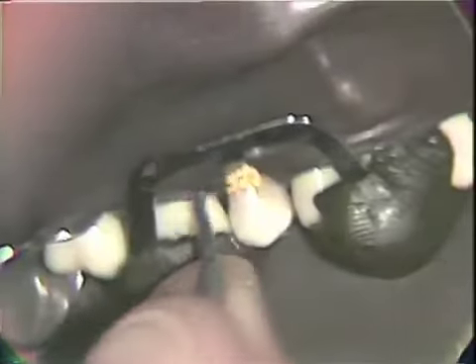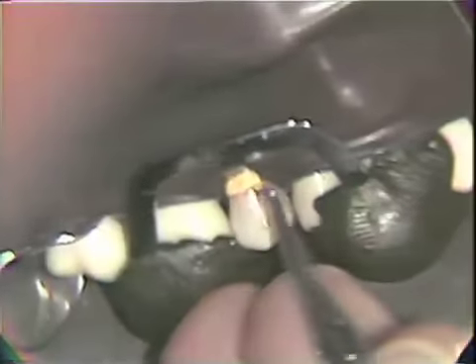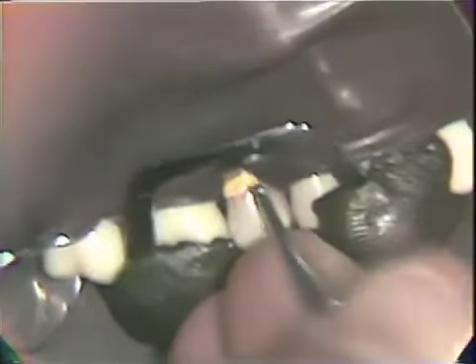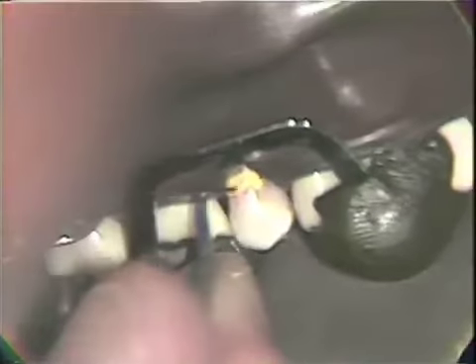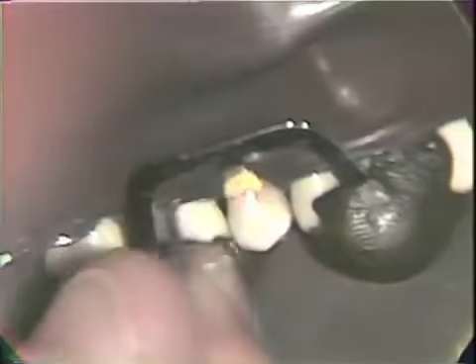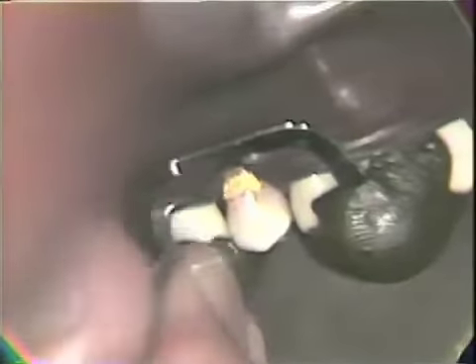Condensation now is nearly complete for this class 5. We're building up to appropriate contour, again with this forceful sustained pressure, overlapping of each condensing action that we apply. I think that we have perhaps a little deficiency yet in the mid-occlusal area.